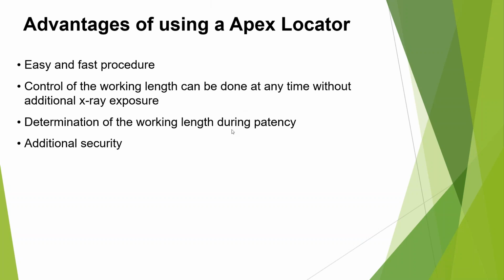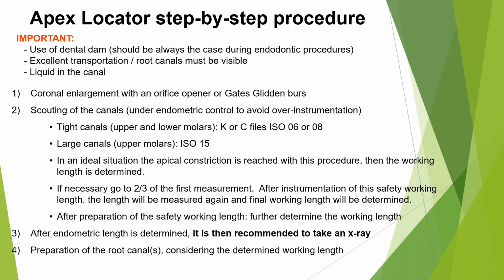Next slide. So here's just a slide that we put together on the step-by-step procedure. First steps are important. Use of dental dam, and we already went over isolation. Should always be used in the case of an endodontic procedure.